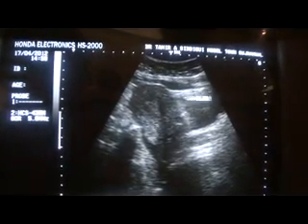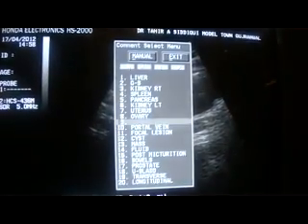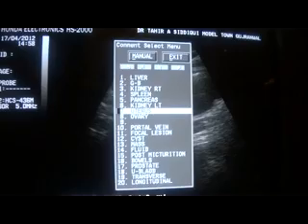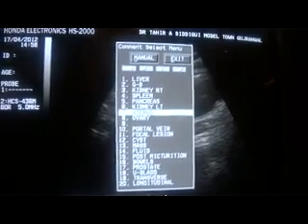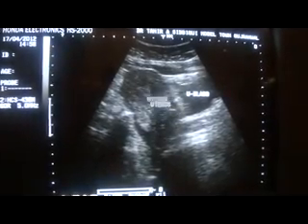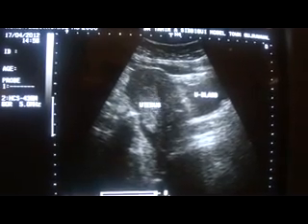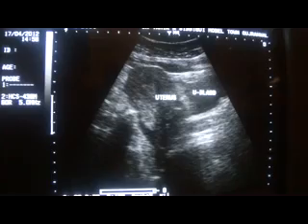And this is the endometrial canal, which measures 7.2 mm, suggestive of the fact that the patient is in the proliferative phase of the menstrual cycle. Now this area is the cervix. And this is the vagina.